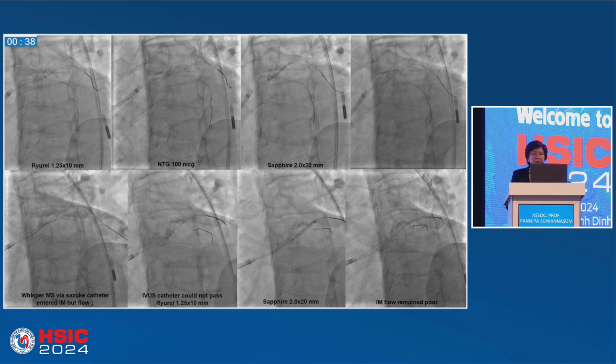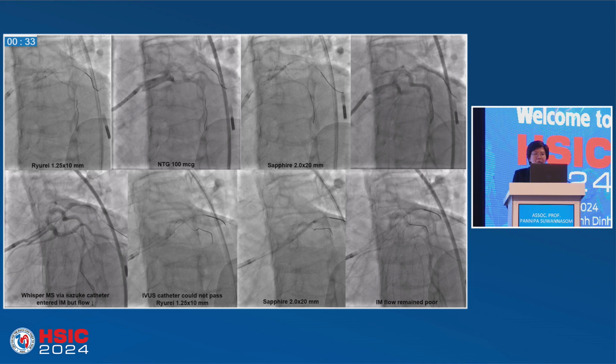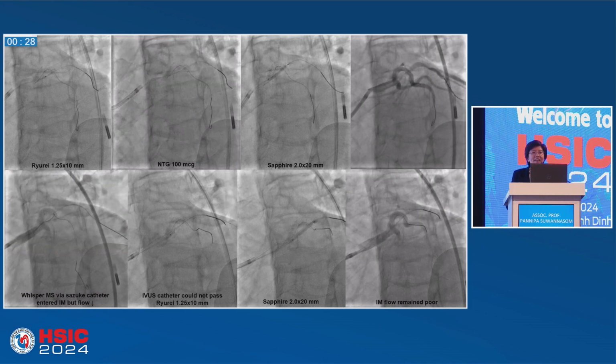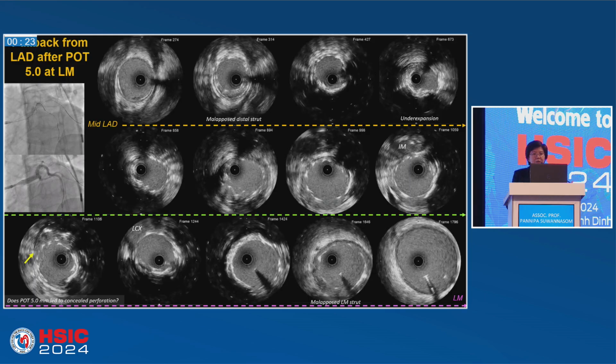Okay, so the problem is now I have done everything, already used the double lumen catheter, and I cannot wire. So at that time, I was thinking, okay, we go back to the previous slide, and you see that actually it's good. I'm not sure whether to say good or not, because we have a malposition here. So I think that even if I have to do some deformation of the left main stent, maybe I have to do that to create a way to go into the true lumen. So be it.